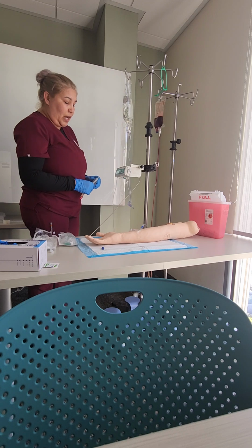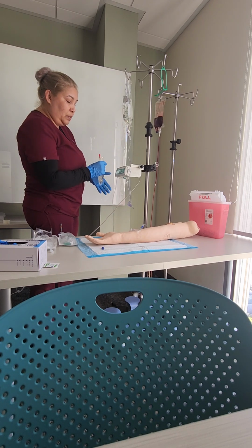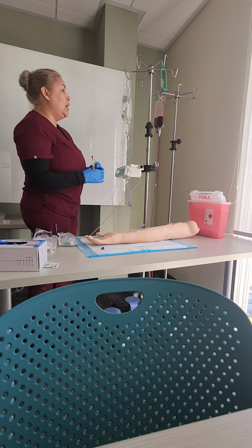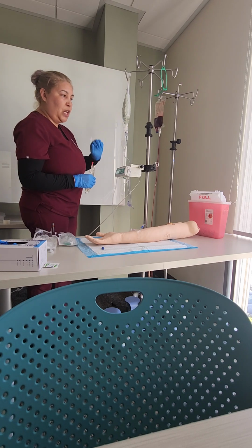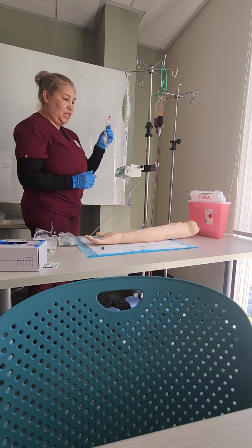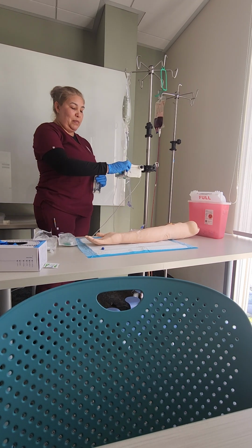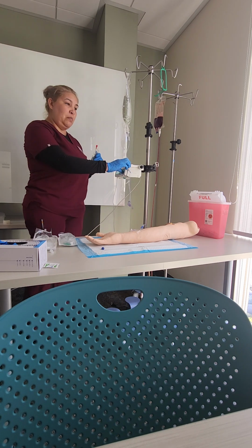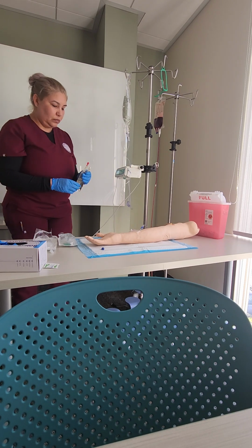Okay, so again, you're not going to feel any pain. This is your antibiotic, just as I explained to you a little bit ago. What you've got infusing in you is just the hydration solution, just so you don't get dehydrated. So it's just fluids. This is your antibiotic. Again, you will not feel any pain. I want to stop my machine before I hang my second bag. So I will stop my machine.